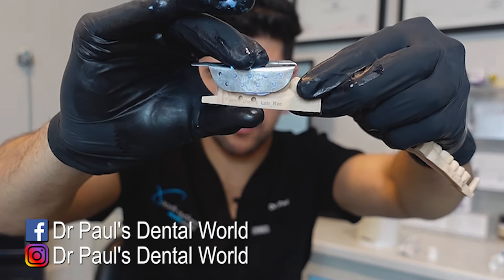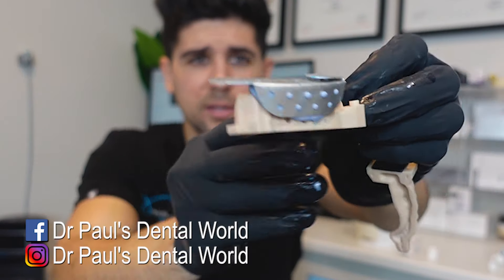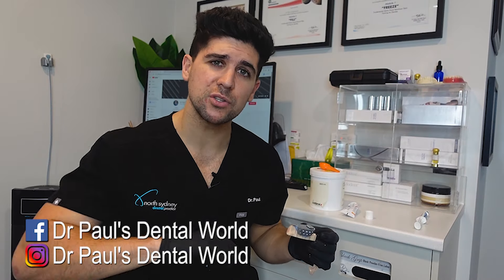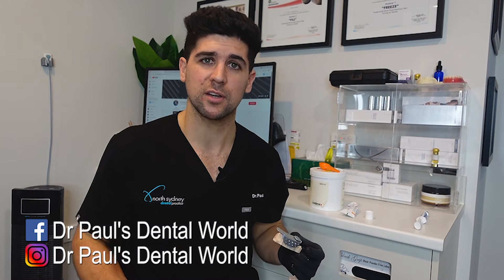Now you wanna make sure that it goes a few millimeters over the top either side — so on the buckle and on the palatal, it's gone over the top. And then we're gonna wait for that to set. Now you don't wanna rush this. If you do rush it and take it out too quickly, it can mean that the putty will deform. If it deforms, it's not gonna be as accurate.